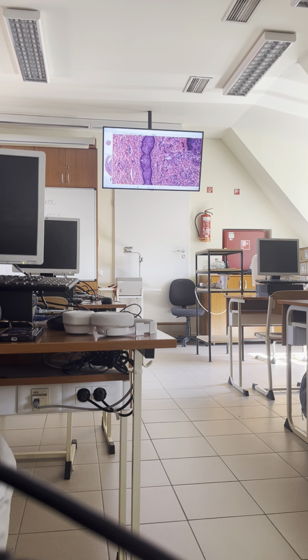And in between the two stratum basale, we have a unified stratum spinosum. Other layers haven't appeared. Okay, so this stratum basale will be the stratum basale of the epidermis of the inner surface of the prepuce. This stratum basale will be the stratum basale of the epithelium of the glans later.